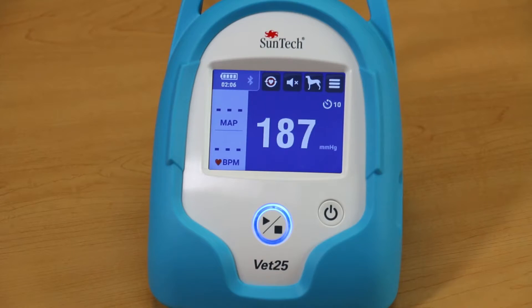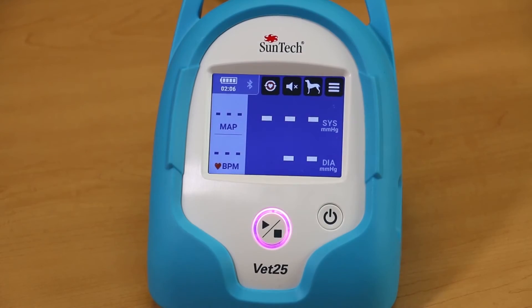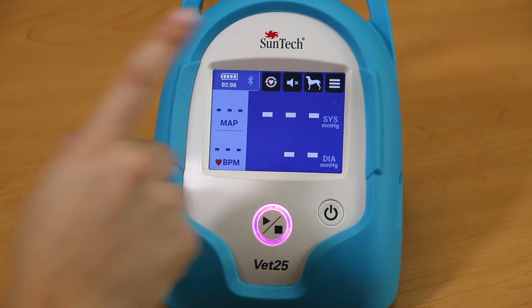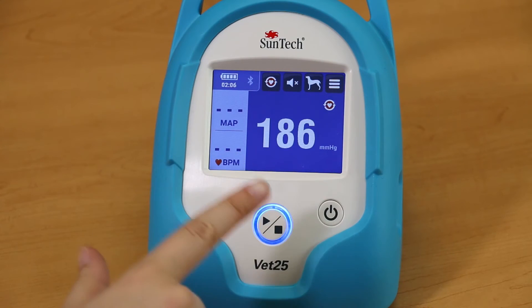Interval BP mode can be ended by pressing the Start-Stop button. The Stat mode on the VET25 allows you to quickly take back-to-back BP readings continuously for 10 minutes. To begin Stat mode, press the Stat mode button on the main screen. To exit Stat mode, press the Start-Stop button.